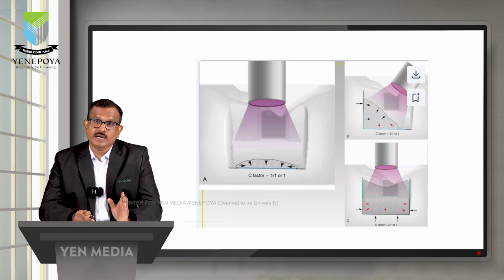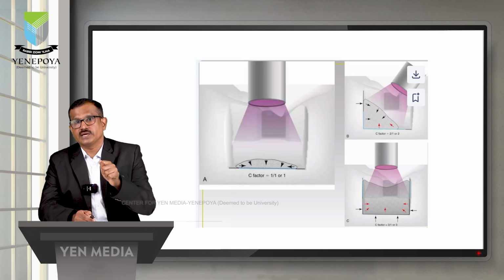This is the picture of roughly how the shrinkage happens. So you can connect two walls to reduce that. You can see how the stress is reduced then. That arrow indicates the stress factor, the polymerization shrinkage that happens.